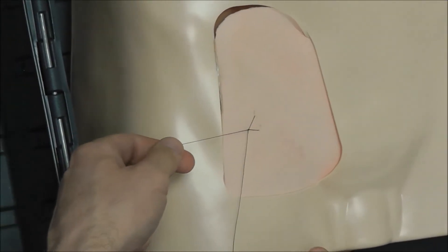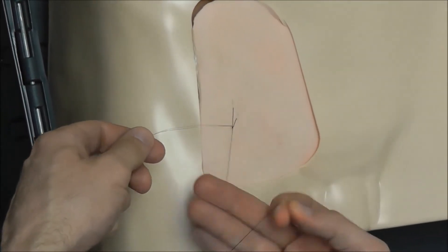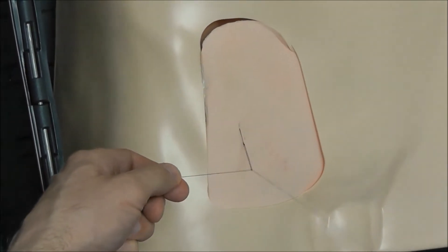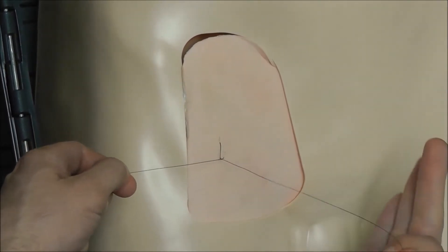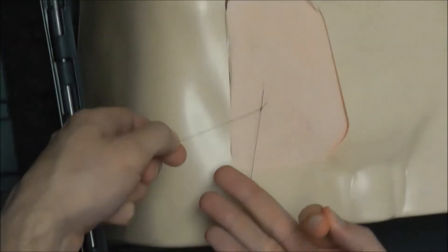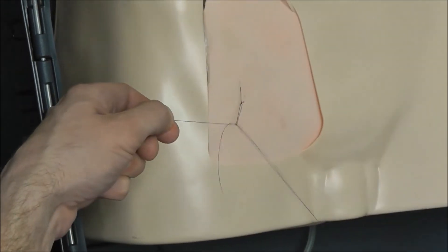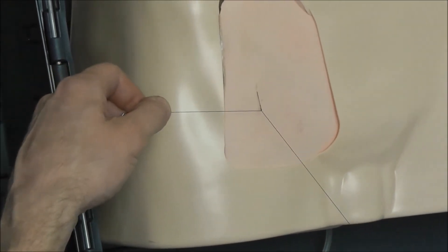It doesn't matter what hand you do it with. Wrap the line under, pull that one under, and there we go. Wrap the line on top of those three fingers, go and grab this one underneath that line, and pull it through. That is the first type of knot.